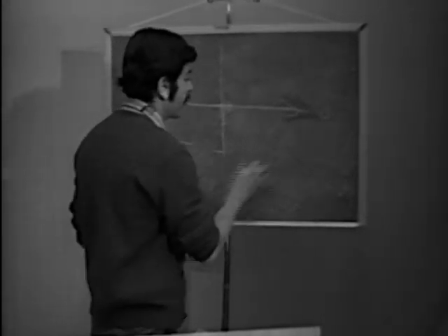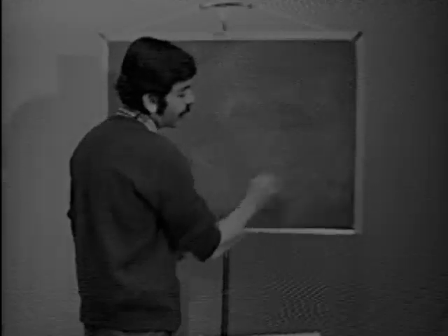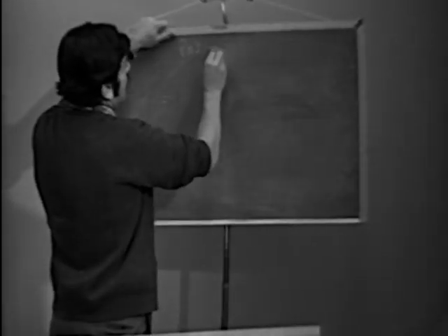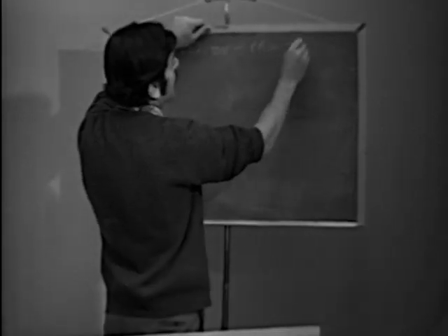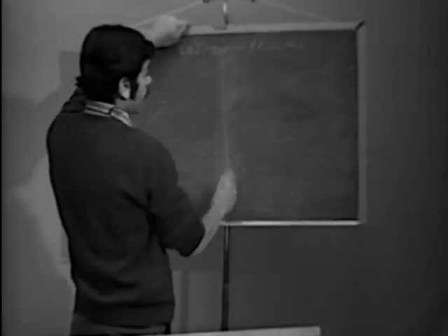Okay, so that brings us to position now. When we talk about position of the heart, we're talking about position in the frontal plane. That's 1, 2, 3, again, AVR, L, F. So this system, 0, 90, minus 90, 180.